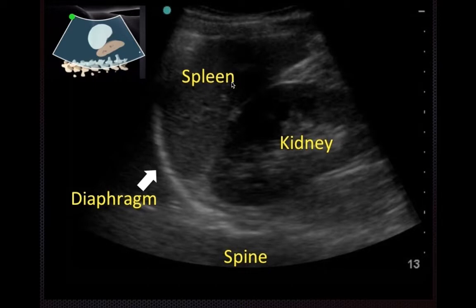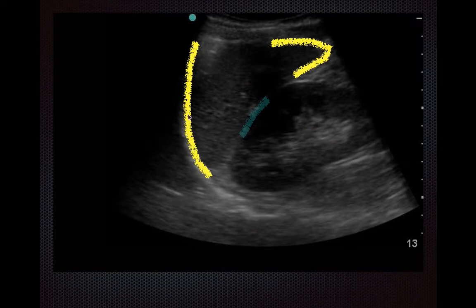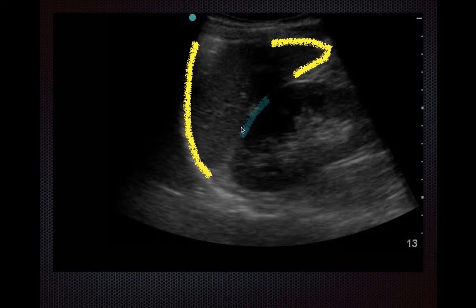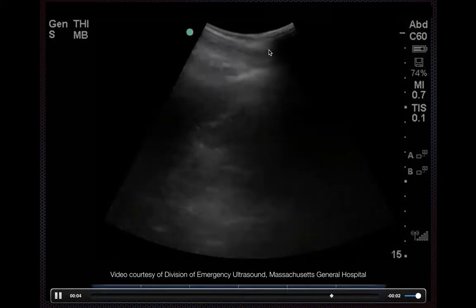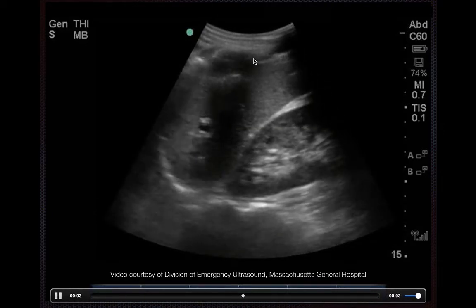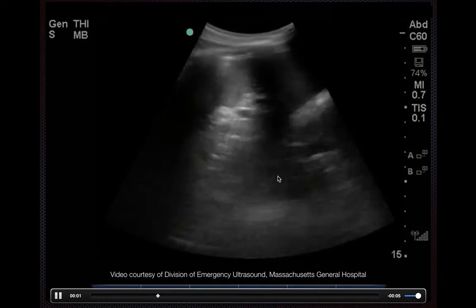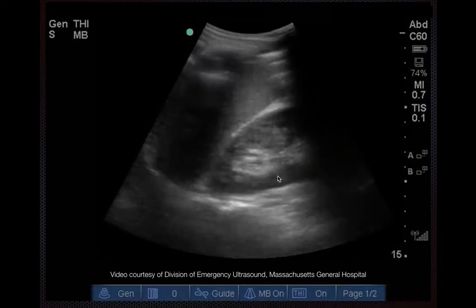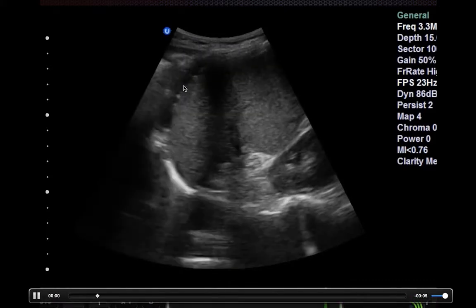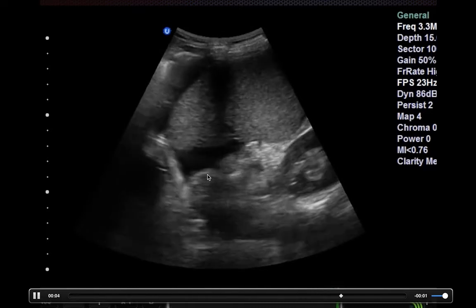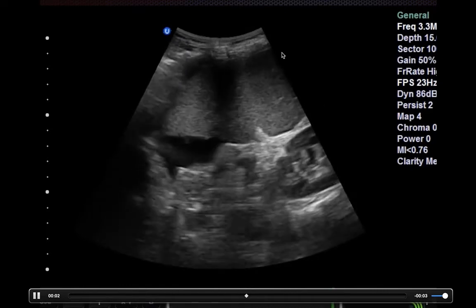In the left upper quadrant, fluid tends to hide above the spleen, at the spleen tip, and also at the inferior pole of the kidney. Interestingly, unlike the right upper quadrant, you don't commonly get a lot of fluid accumulation between the spleen and kidney, primarily because of the ligaments within the abdomen. You do the same sweep technique, interrogating from anterior to posterior. Here's a clip of a positive scan where you can see some fluid above the spleen just beneath the diaphragm.